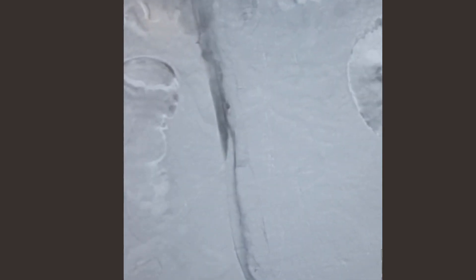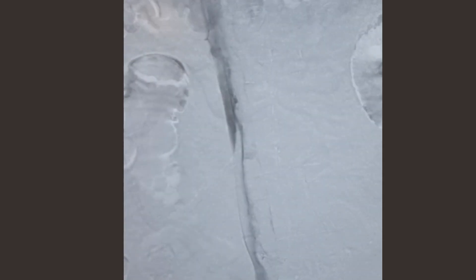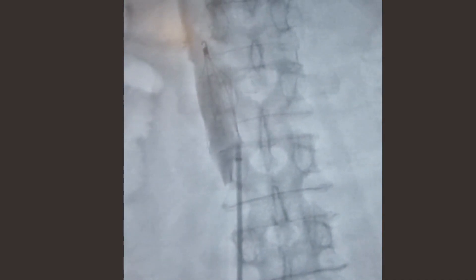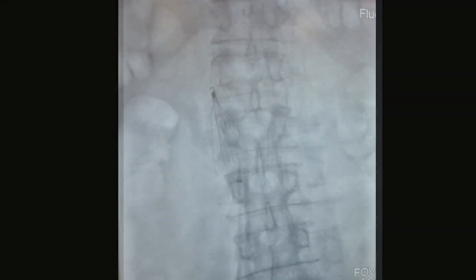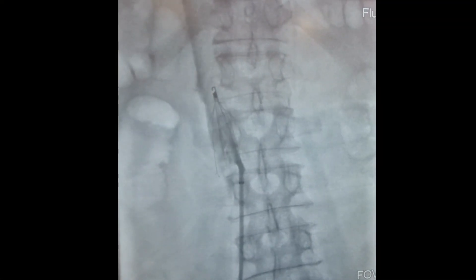Then the position is confirmed by injecting contrast. The IVC filter is introduced into the sheath with the help of a pusher or stylet. Then the placement of the IVC filter is confirmed by injecting contrast again. The final angiogram confirms the good placement of the IVC filter.